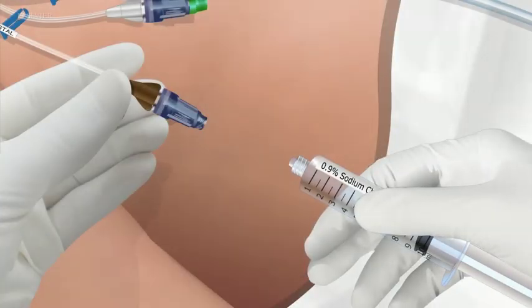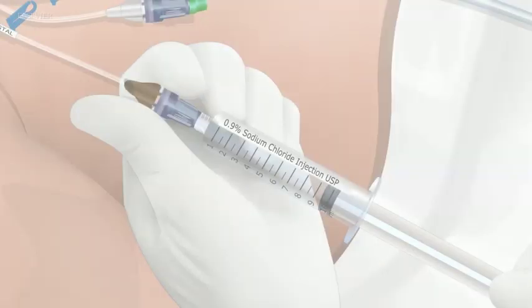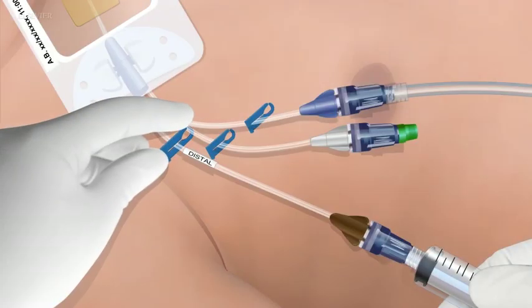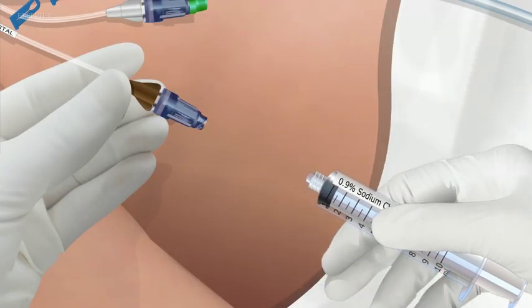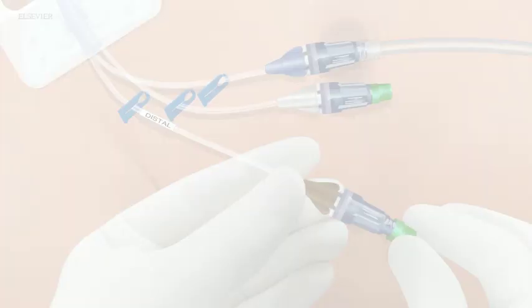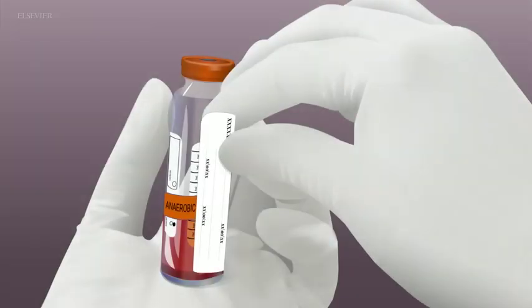Lock the port with solution per the manufacturer's recommendation and per the organization's practice. Reclamp the port before removing the syringe. Open the clamp on port with the IV tubing and resume the ordered infusion. Prepare the specimens for the laboratory.